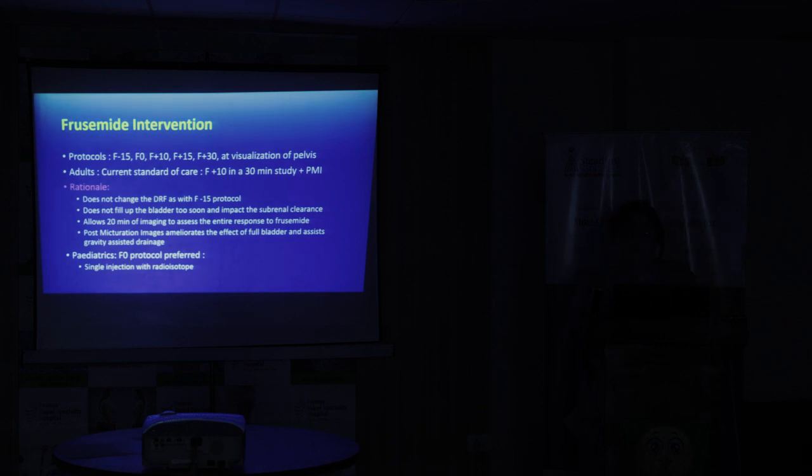Okay. Now, in certain situations, where you have a large capacious pelvis, a patient has had a pyeloplasty but there's still a large capacious pelvis, or if you feel that there is some functional obstruction, you can actually give Lasix 15 minutes prior to starting the investigation, right?